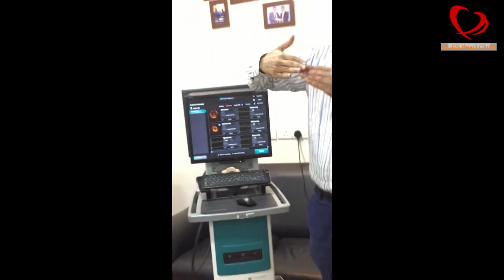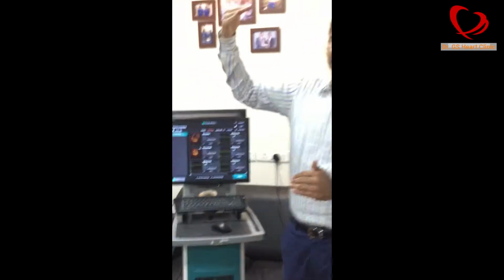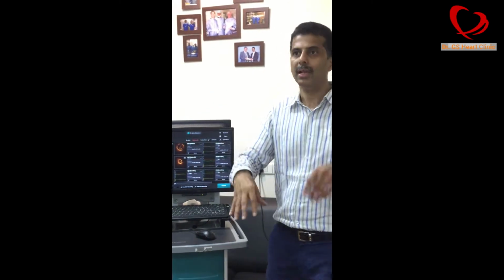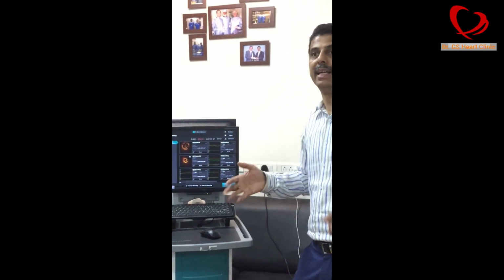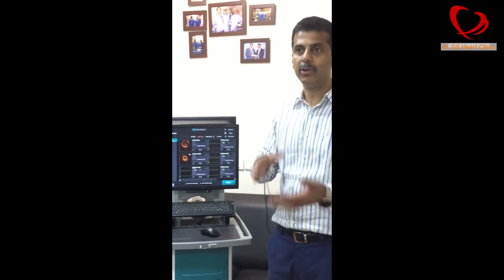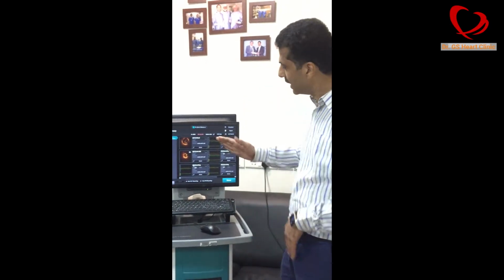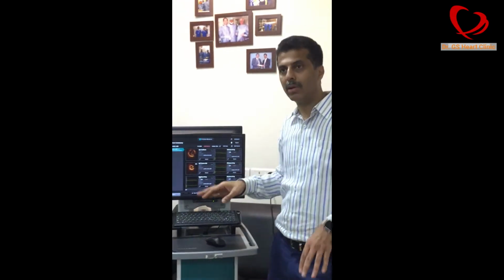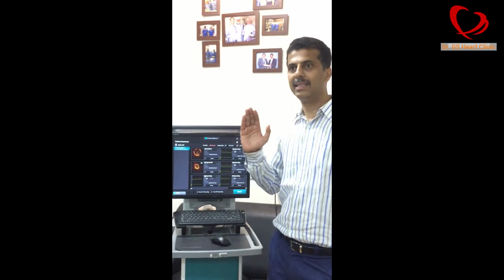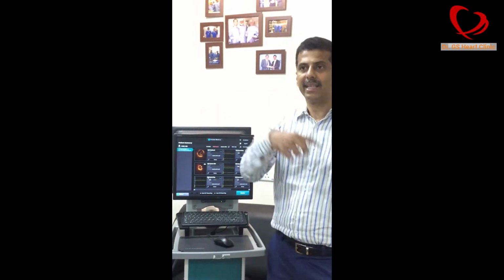Correct. So definitely FFR is the supreme. FFR has got higher scientific value and evidence. So we have to go by it, but looking at his whole angio, that's evidence also. Now we have documented that he will benefit from this procedure. We have huge evidence now. So based on the OCT alone and the angio alone, I was quite satisfied that he would need a stent because it's a large territory.